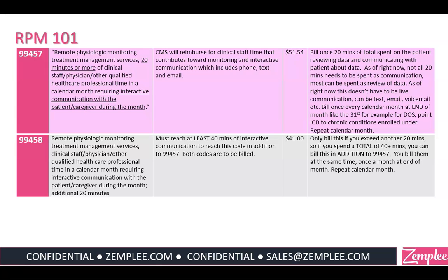So they're going to be watching this data that comes in, responding to it, again, not live, maybe every other day or every 3 days or once a week. And when they document in the system, every 20 minutes of documentation, the first 20 minutes, once they get to minute 20, and they've had some sort of interaction that calendar month, this one's a calendar month, they could successfully bill for 457, which reimburses about $51.